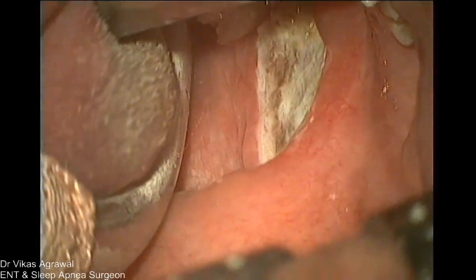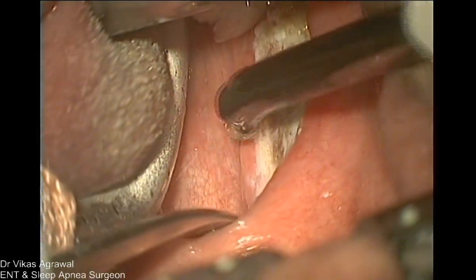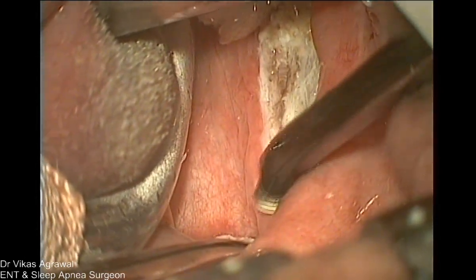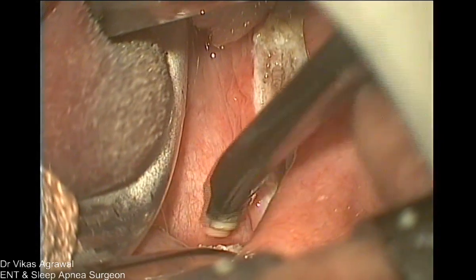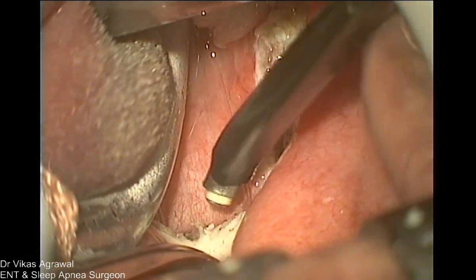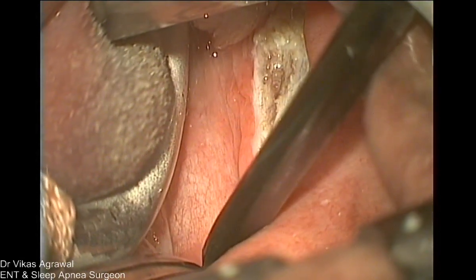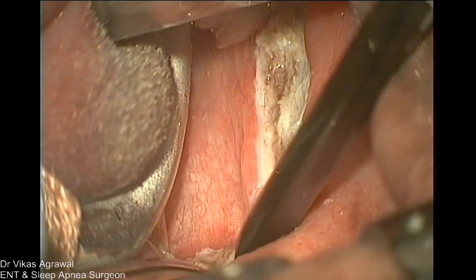I'll try to centralize. This is the final extent of the surgery. You can see the posterior pillar here. Right. This is cut at 90-degree angles. So this is 90 degrees, and just to take care of the uvular artery, I am coagulating a little more in this area.